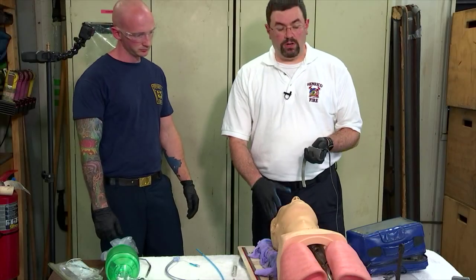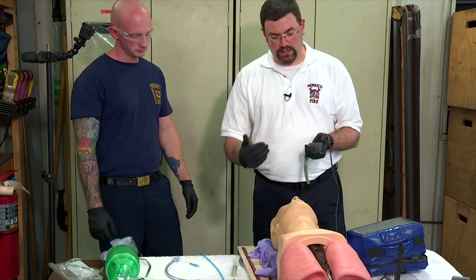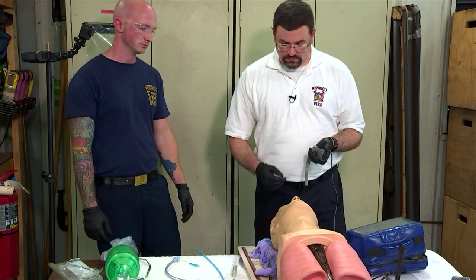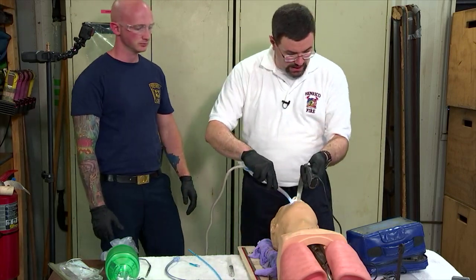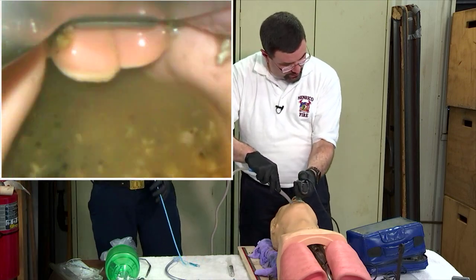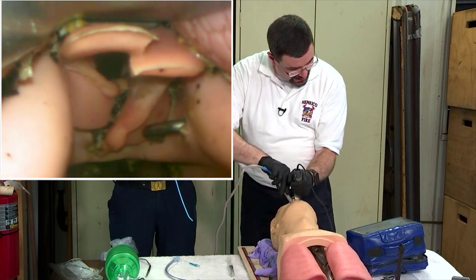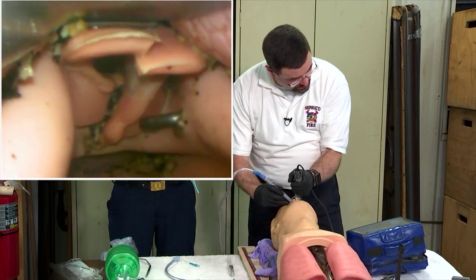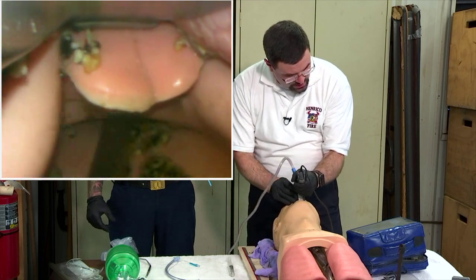I've got one more round to show you, and I'm going to be using a borrowed CMAC here so I can actually record the airway view of this. And Sean's going to give me a little vomit. I'm going to grab my suction catheter and begin suctioning again as I insert the device, hitting record there. So I'm suctioning on the way down, identifying as I go. I've got a view of the epiglottis there. I'm going to lift the epiglottis, continuing to suction behind the cords. I'll suction the cords a little bit to clean those off. And then I'm going to park that catheter again behind the cords.